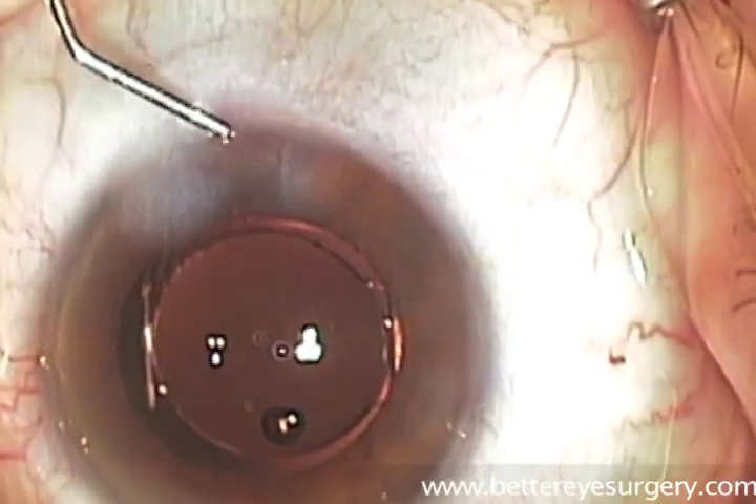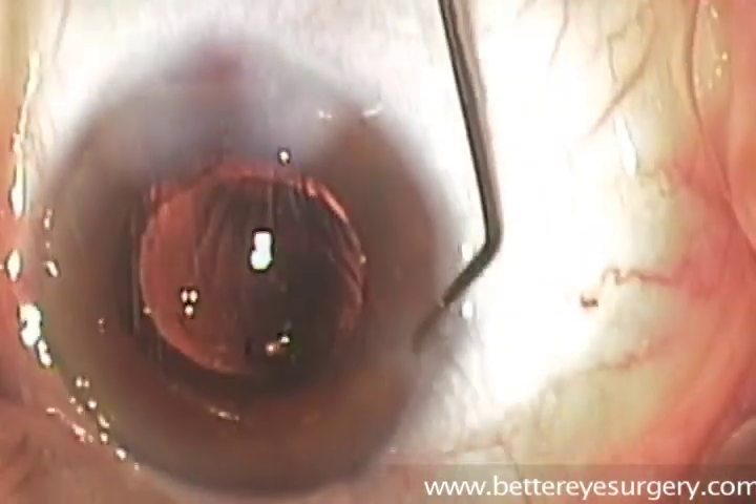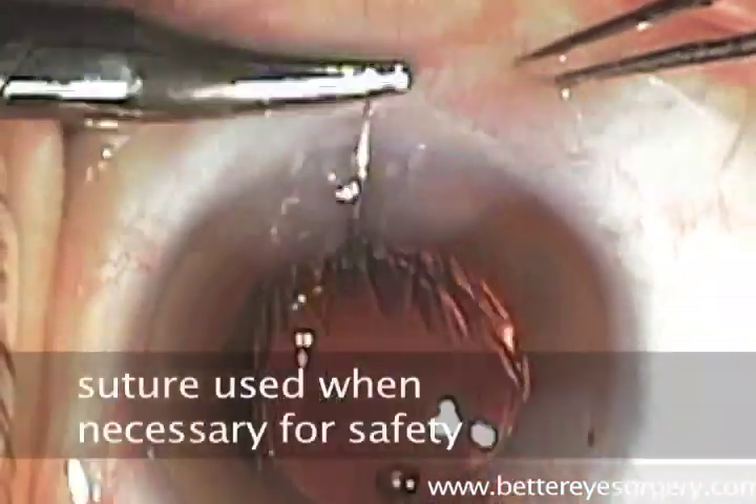At the end of the procedure, we intentionally cause swelling in the cornea around the wound that was placed in the eye. This will seal the wound to prevent leakage of fluid out of or into the eye.